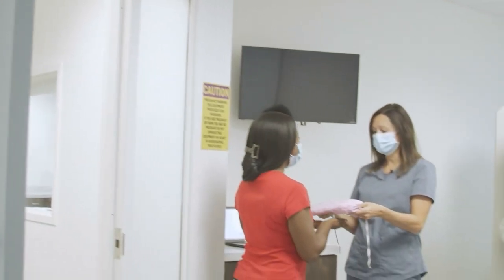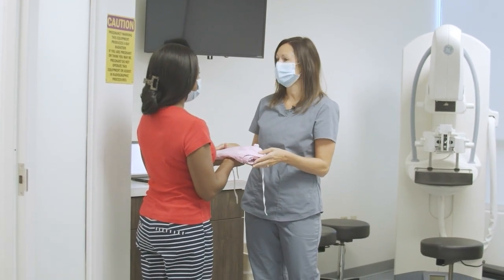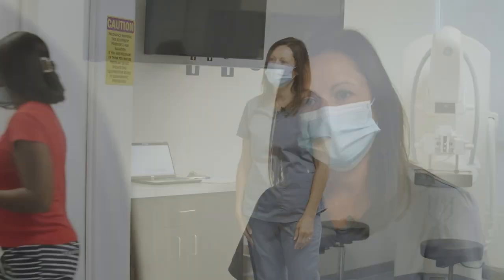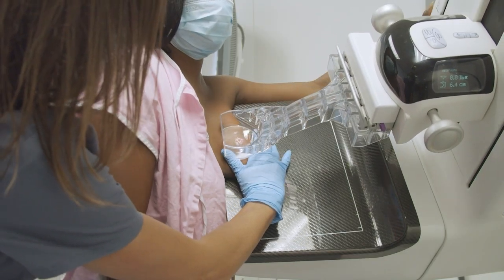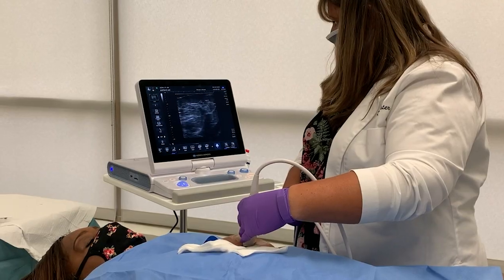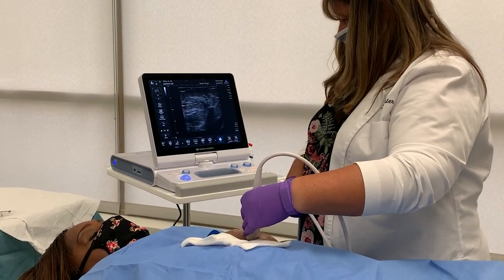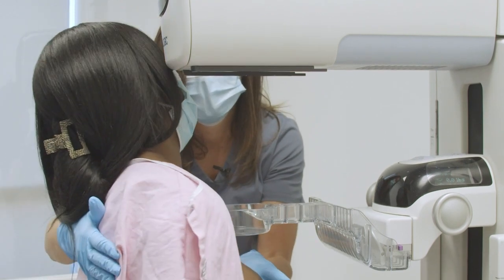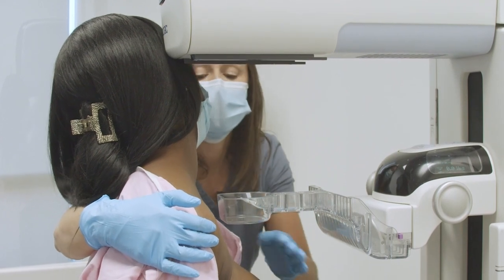When you are called back after your screening mammogram, you will have either a diagnostic mammogram or breast ultrasound, or both in some cases. The radiologist will determine which type of imaging shows the suspicious area best. A technologist will perform mammograms using special paddles and equipment, or an ultrasound, that allow a radiologist a closer look at the area of concern. If you have calcifications in your breast, you will have the area magnified so the radiologist can see their size, shape, and how many there are.